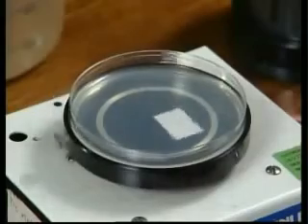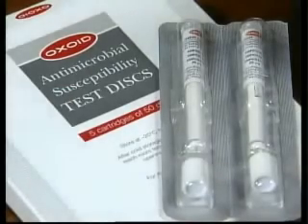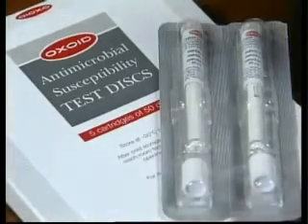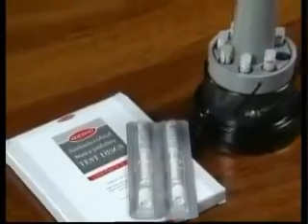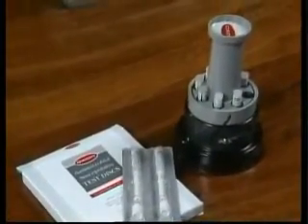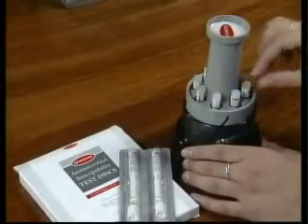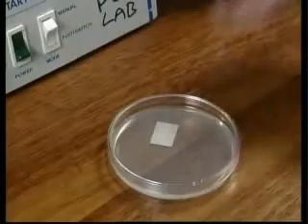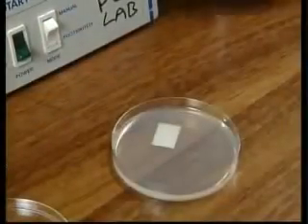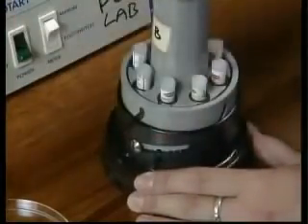Having inoculated the plate with the rotary plater, antibiotic discs must be placed at the interface between the test and control inocula. This can be facilitated using an automatic disc dispenser. These hold up to 8 cassettes, each containing up to 50 discs impregnated with antibiotics. This means that different antibiotic combinations can be used to test the susceptibility of a range of bacteria.